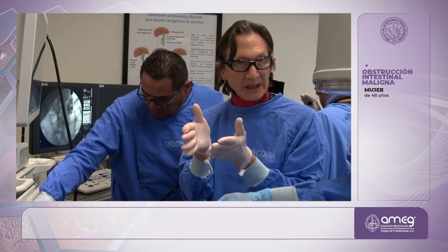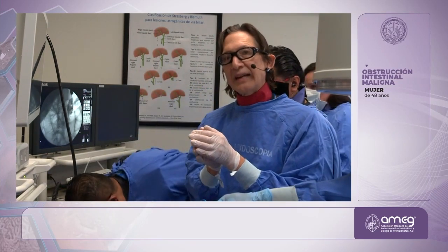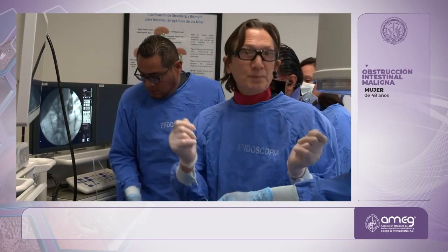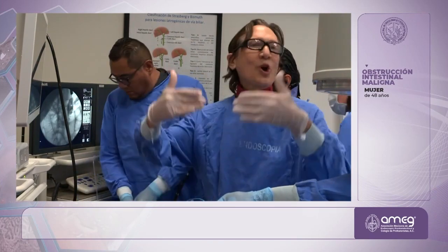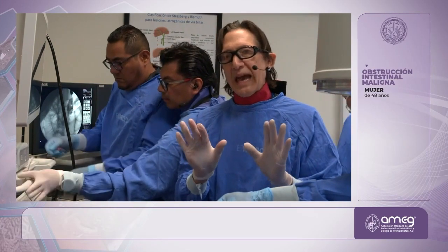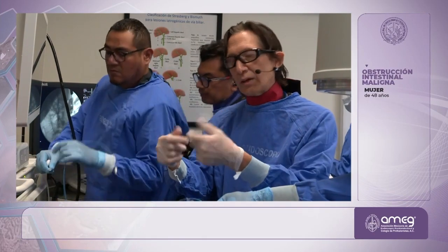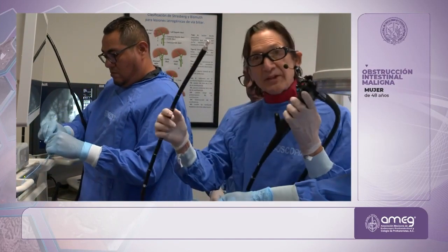That's our target. And what we don't want is that the oral enteric catheter starts to get all coiled up and gets pulled back. So once it gets pulled back, we have to start all over again. And so we don't want to do that. So we want to make sure that we don't do anything that will cause the OEC, oral enteric catheter, to fall back.